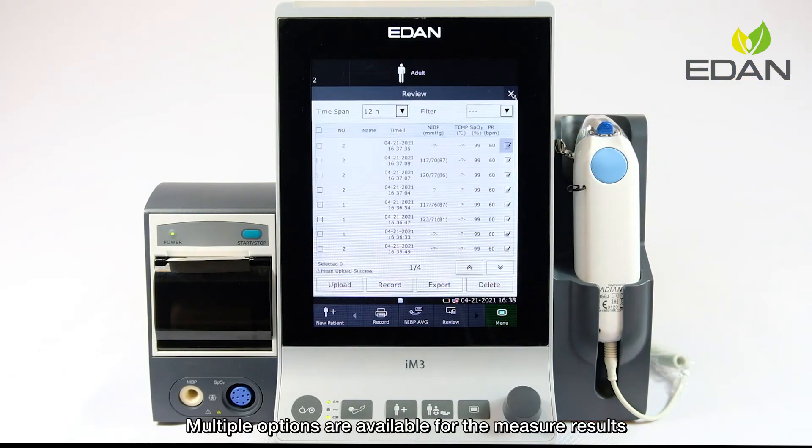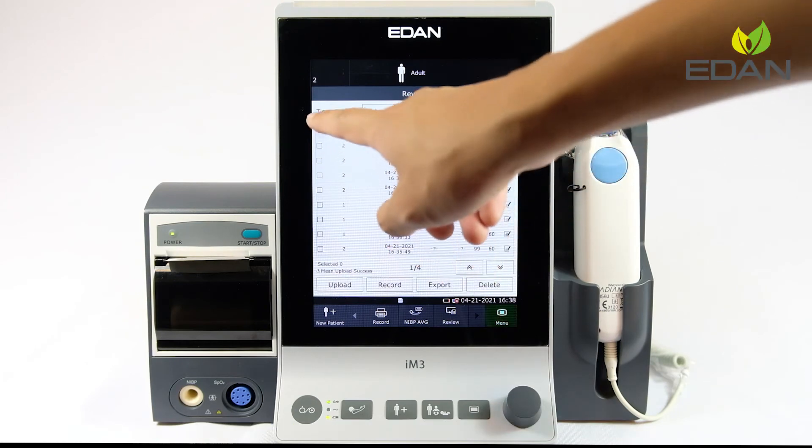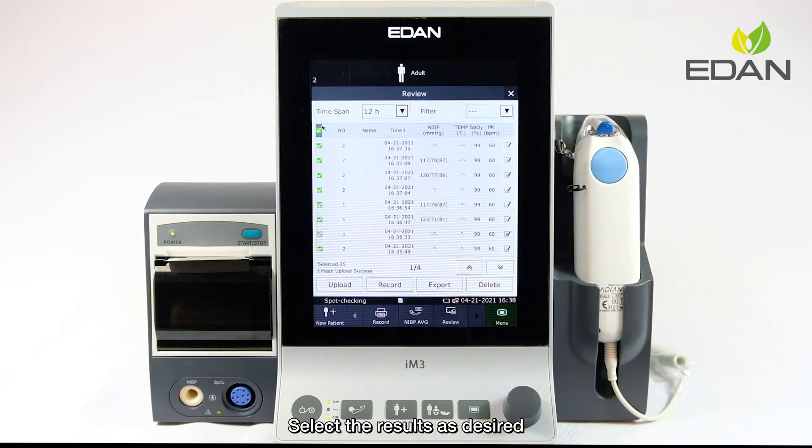Multiple options are available for the measurement results. Select the results as desired, and they can be uploaded to EMR in batches, recorded through the optional recorder, exported to a USB disk, or simply deleted.